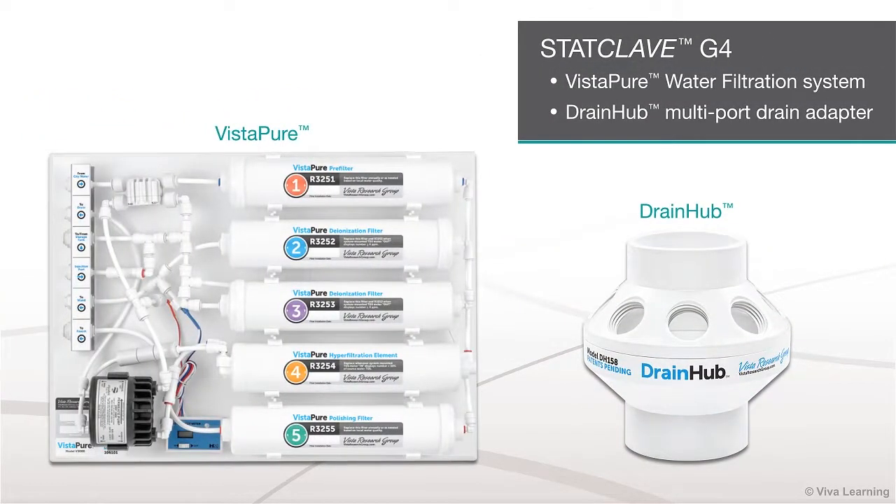To make the most of the StatClave G4 Chamber Autoclave, SICAN recommends that you pair it with the Vistapur water filtration system and the DrainHub multi-port drain adapter.